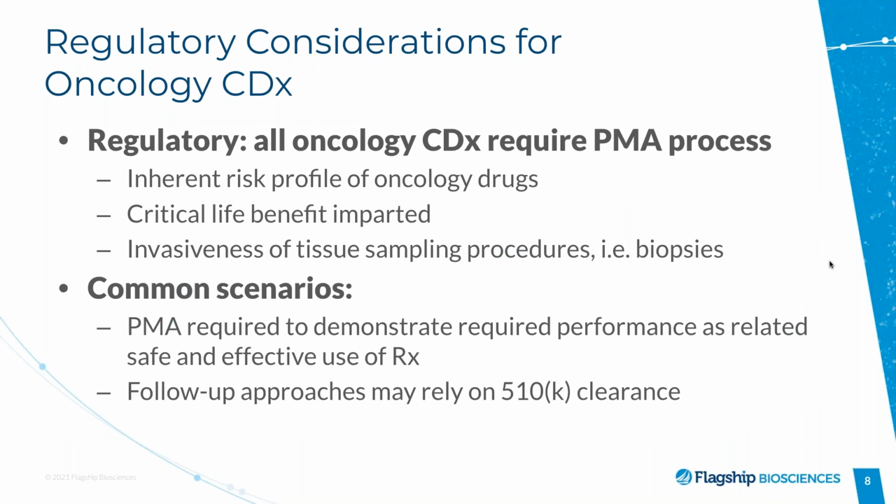So, Susanna, would you feel like jumping in and talking about regulatory considerations specifically around oncology companion diagnostics? Of course, and to David's point, it's really important to engage in an early dialogue with the regulatory agency from a strategic level, and then expand into implementation of that strategy. In oncology, that is particularly important because of the large number of targeted precision medicine-based drugs, and the risk level associated with the companion diagnostics with oncology drugs, because oncology drugs have an inherent risk profile.